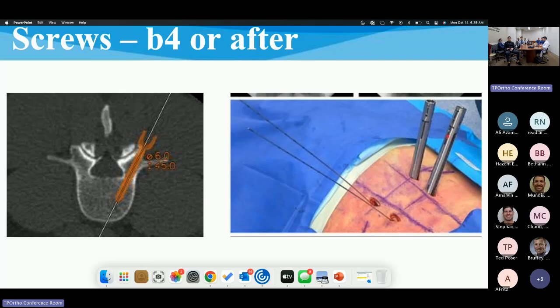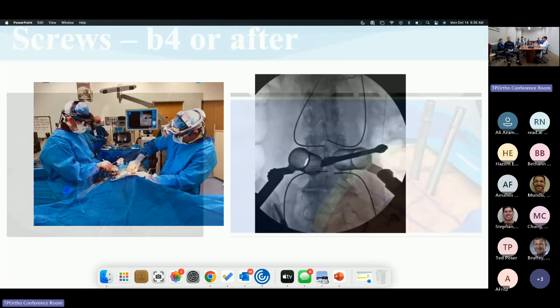And then contralaterally, I will just cannulate the pedicles with an awl, tip, tap. And if you use the first dilator, you can actually drop a K-wire through that dilator into the pedicle. And if you do, occasionally I'll show you how to do that. But then you have basically pedicle fiducials in the pedicles, ipsilaterally to the TLIF. You've got the screws in contralaterally. You can just bend those K-wires out of the way.